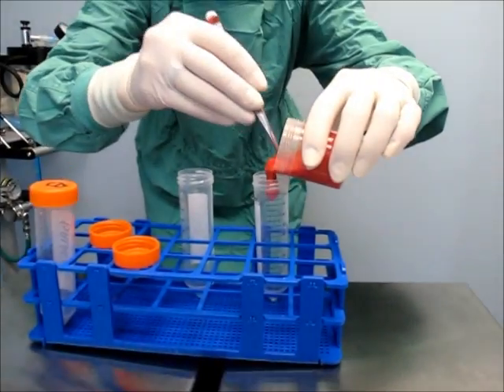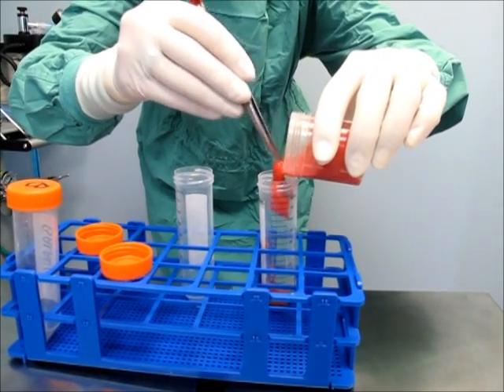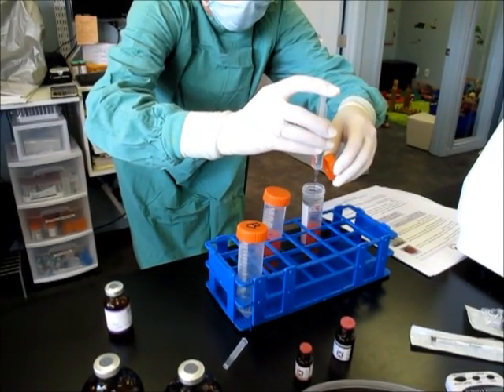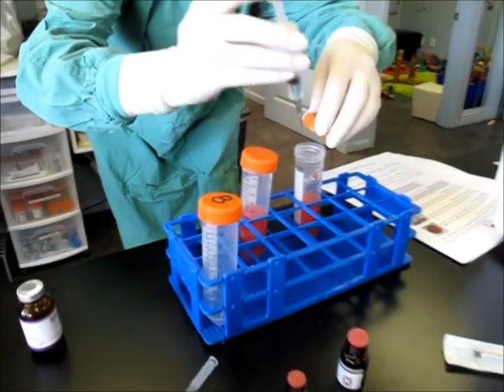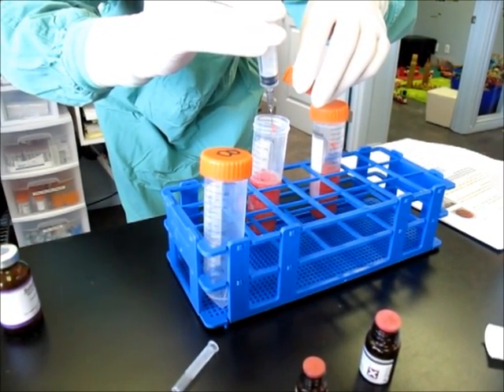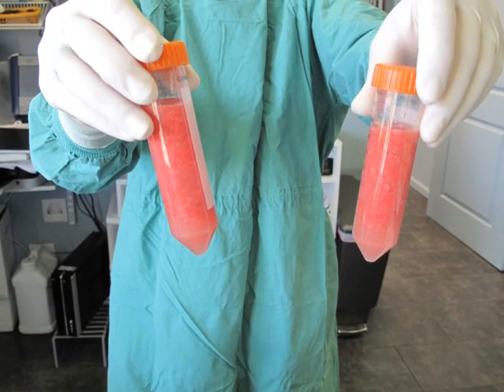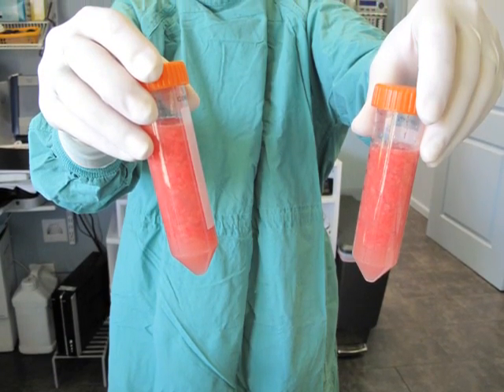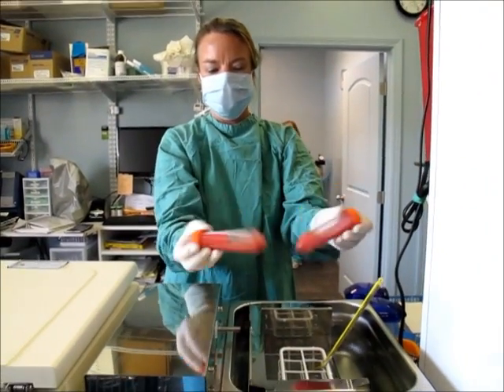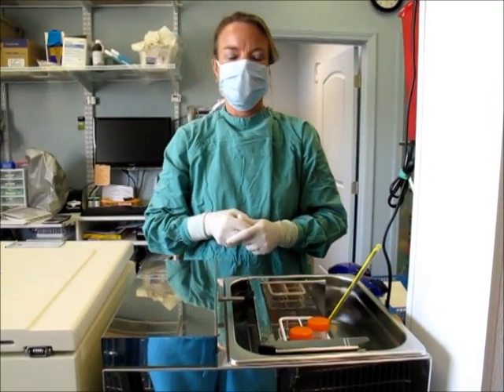I am putting the fat into two tubes for further processing. After we've added the digestion enzymes, they go into the shaking water bath at 37 degrees for 45 minutes.